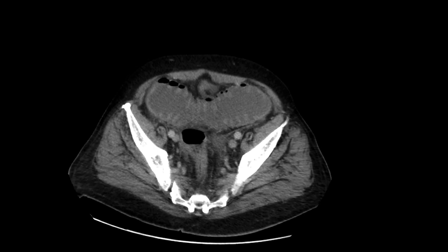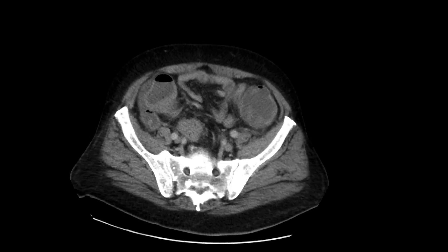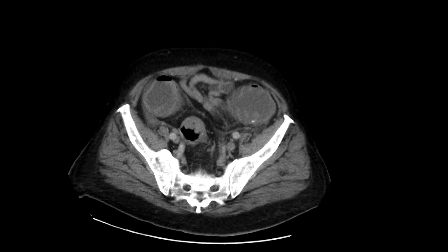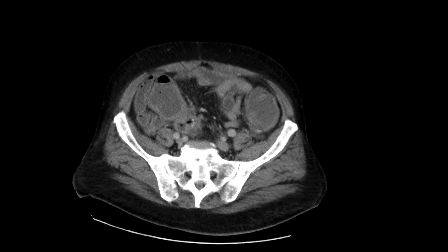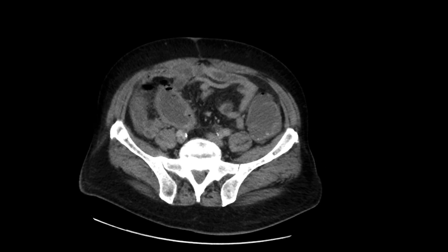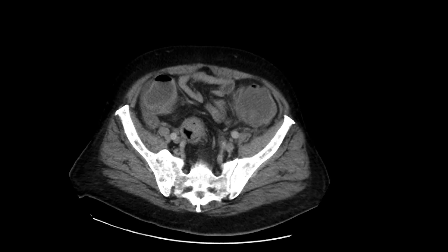The wall's a little bit thickened. Maybe there are a few nodes in this location that are a little bit prominent. So certainly, at the very least, there's a stricture causing a large bowel obstruction, given that wall thickening and that adenopathy. We're worried about an underlying cancer over there.